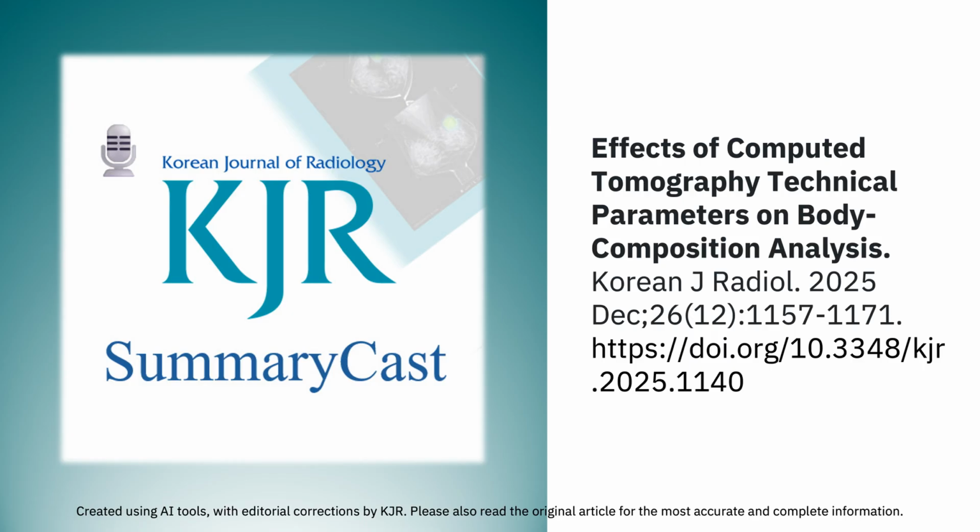It is. The authors also flagged that the strength of the IR algorithm matters. Most vendors offer multiple levels of IR, and higher levels mean more smoothing and potentially larger effects on BCA metrics. And now we have deep learning-based reconstruction, DLIR, which is even more powerful at noise reduction.